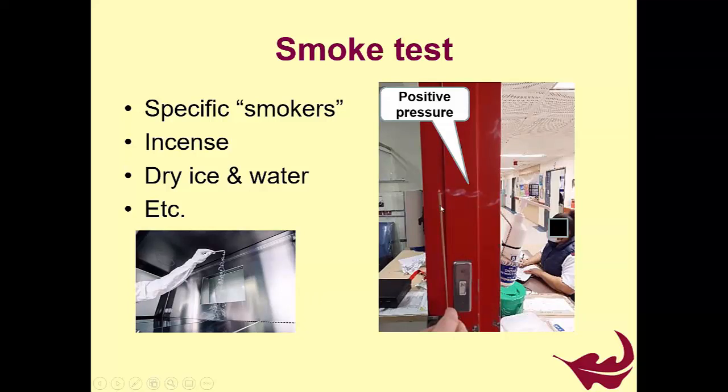So you see me holding it here, and this room has got positive pressure to the rest of the ward. So you can see that it is blowing the air into the rest of the practice essentially. So this would show you this is positive air versus negative air.